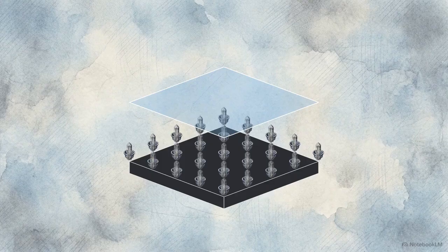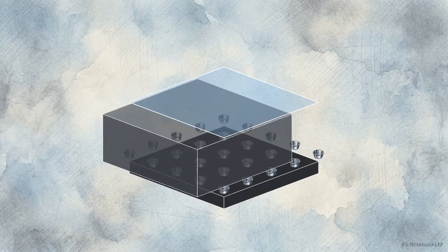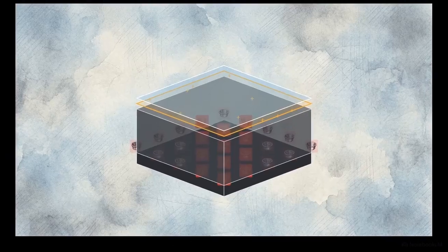To bypass the unsharpness caused by optical scatter and improve efficiency, engineers developed direct digital radiography. This architecture solves the optical problem by removing the scintillator middleman. The capture material is replaced with an amorphous selenium photoconductor. When an X-ray photon hits, it converts directly into free electrical charge carriers, generating negative electrons and positive holes. To organize these charges, a surface electrode at a positive potential attracts and discards the negative electrons. The remaining positive charges are drawn straight down into the charge storage capacitors, instantly forming the latent image.